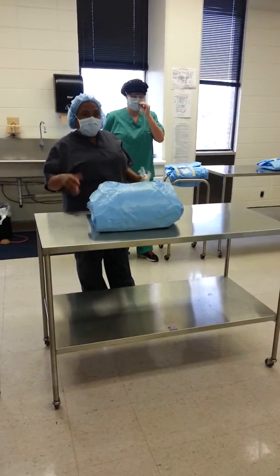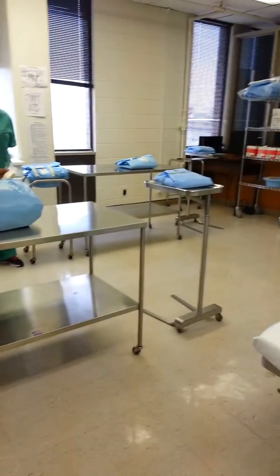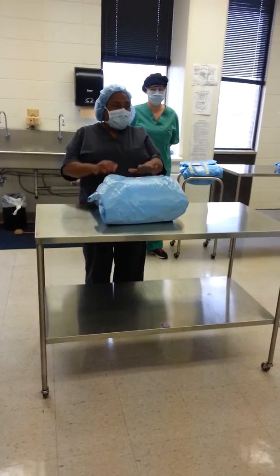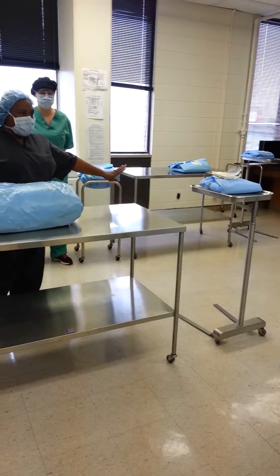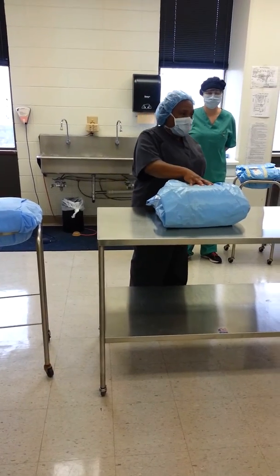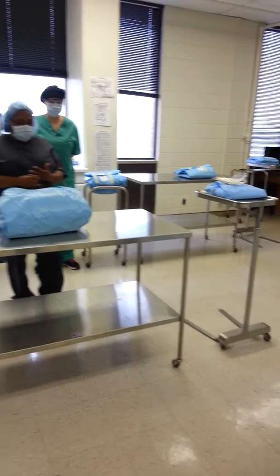Prior to starting, I go to the sterile core or sterile room, and I get my pack, my basin pack, and my gown and glove. And I position them in the order that they should be, okay? The first thing you want to do is open up your pack to make my sterile barrier. My basin pack is second, my gown and glove is third, okay? Basic pack or linen pack. My basin for the ring stand, and my gown and glove for the mayo.